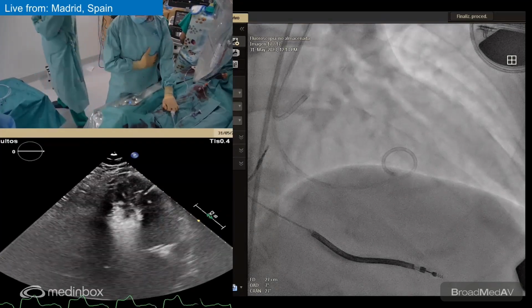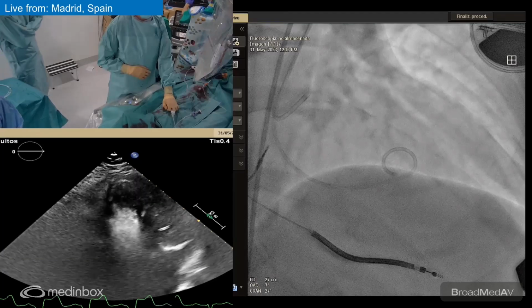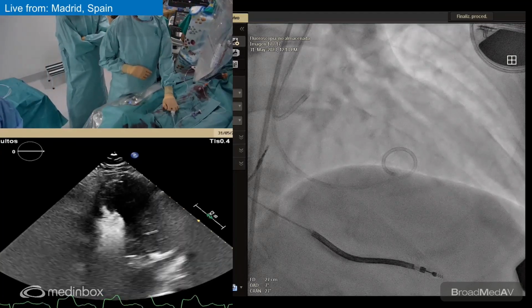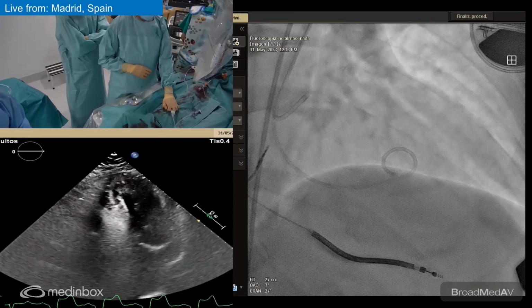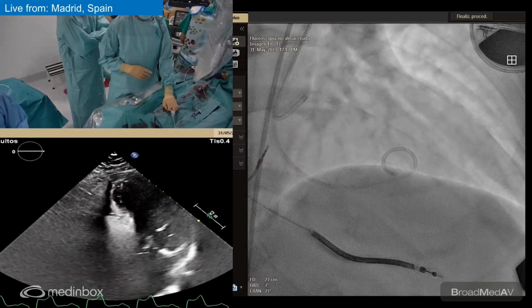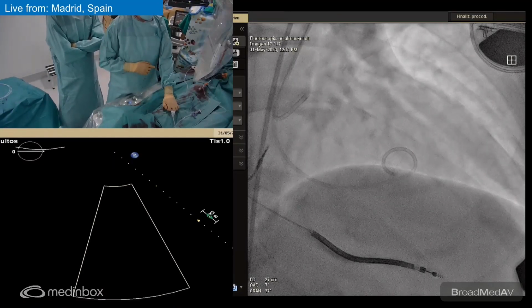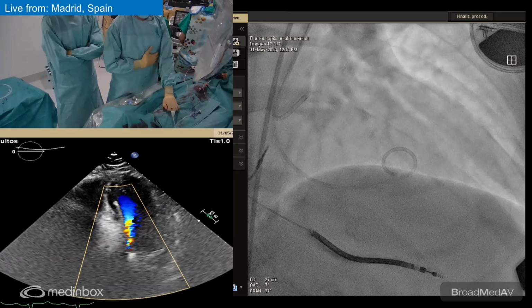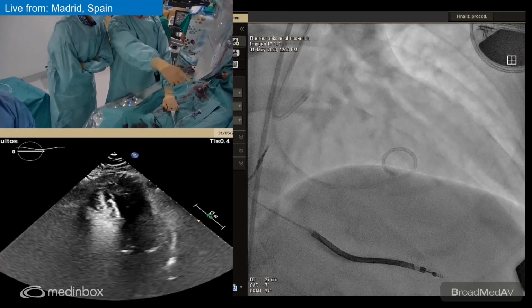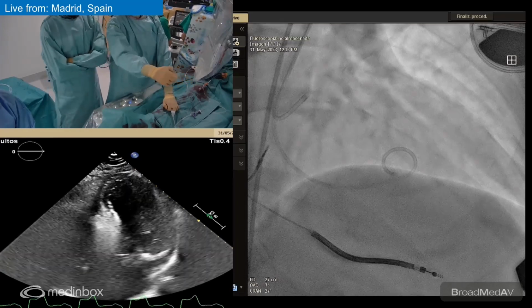Is there any question from the audience? The consistency of the septum has definitely changed. It makes a kind of acoustic shadow. And probably it's the site, no? Is it the mid septum? Probably. From the mid septum and downwards, the subendocardial part of the left ventricle is also more opacified than previously. But the mid part seems to look not marked, the contrast.